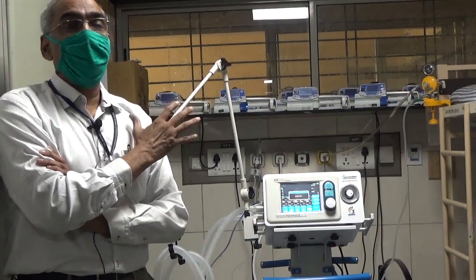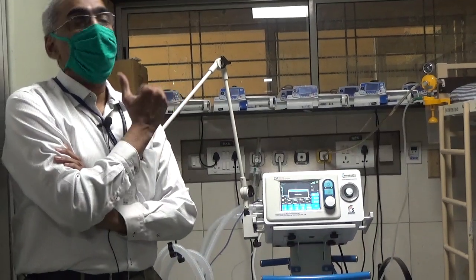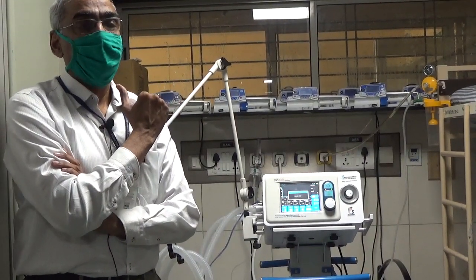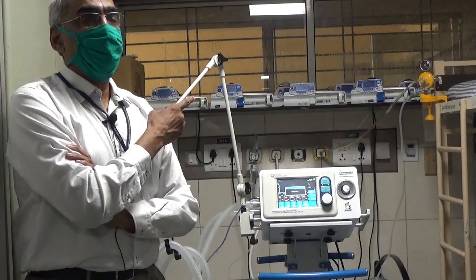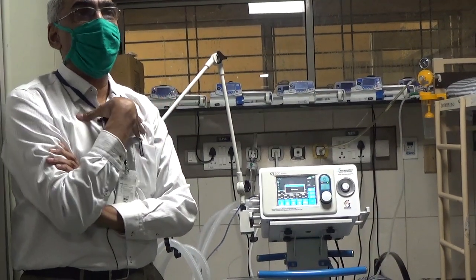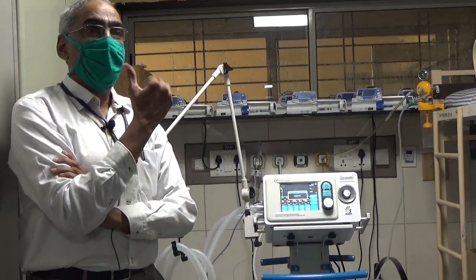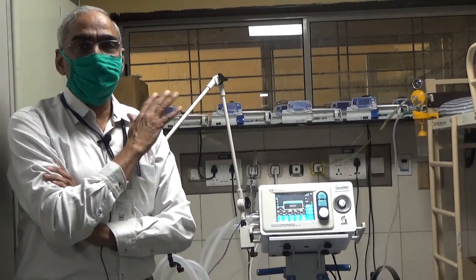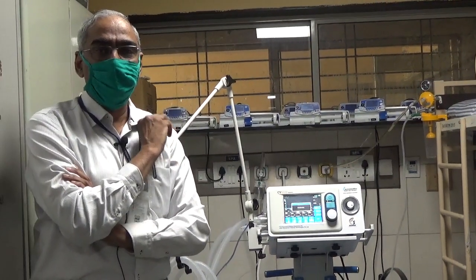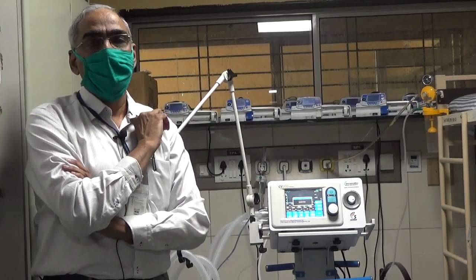But it is always better in pressure support, non-invasive, to keep the set rate on the lower side. The other adjustments that you can make is to the positive end expiratory pressure, especially if a patient has got chronic obstructive pulmonary disease or asthma, then slightly higher PEEP levels may be required. So this is about how you use non-invasive ventilation.